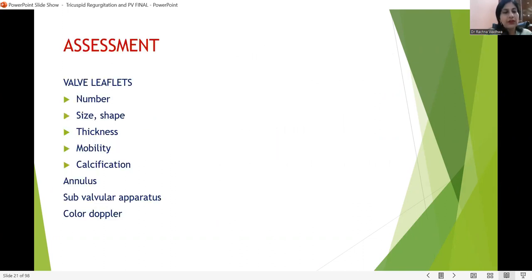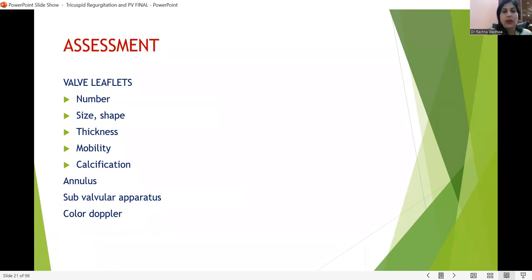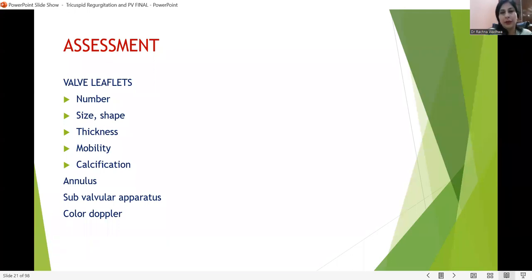What should we assess? The number of valve leaflets, their size, shape, the commissures, thickening, mobility, and if there is any calcification. How is the annulus — its size and shape — and the subvalvular apparatus. Color Doppler and spectral Doppler analysis, continuous wave Doppler, and pulse wave Doppler will give us the values of quantitative assessments.